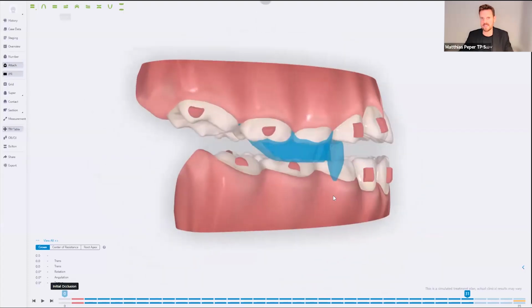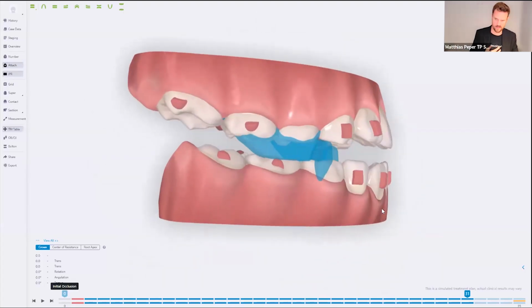But what we personally do is, if we have retroclined upper anteriors and there is no space at all, we still use the pre-MA phase. We still do the proclination of the upper anteriors first to really create space. And this is what I would like to explain: it doesn't matter which type of software you use. We can program it very individually.